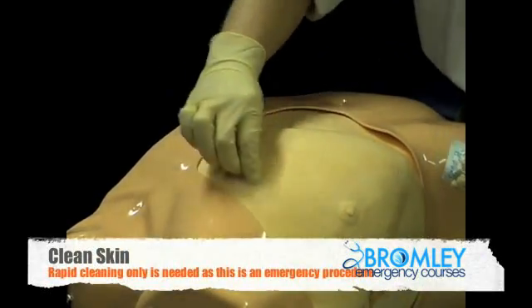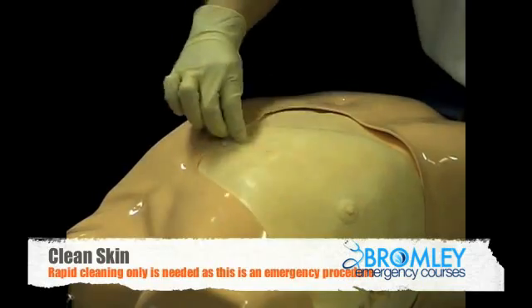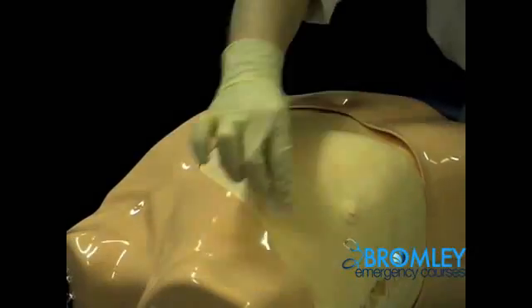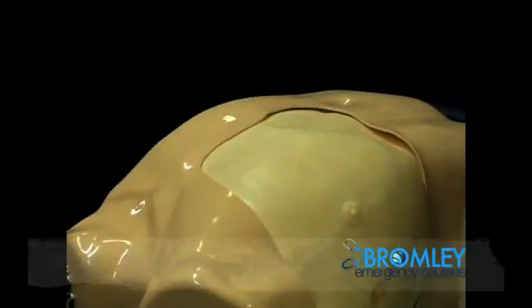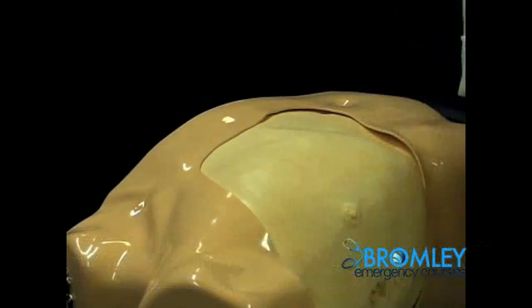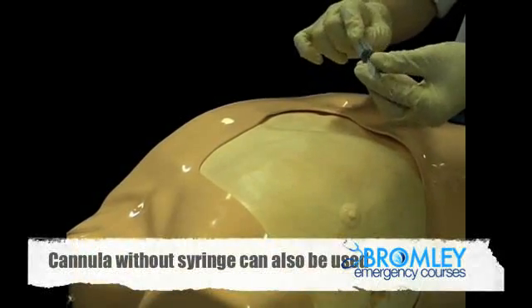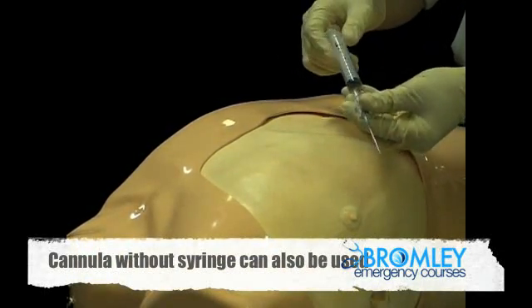I'm going to clean the skin. Then I'm going to take my cannula, remove the bung off the end, and insert my syringe onto it.